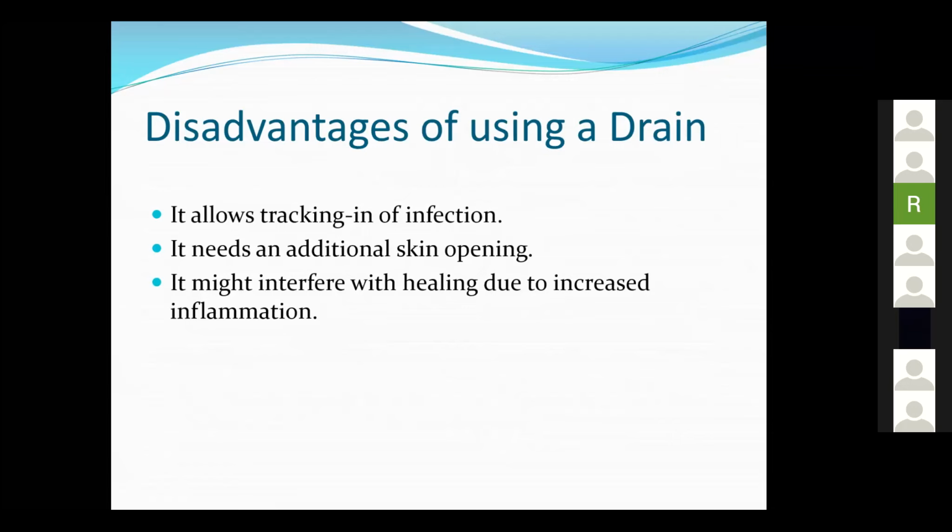I can give you an example: when we do a mastectomy, you want the skin flaps to be approximated. So we put the drains there, but obviously the seroma keeps coming out, so you have to empty the bottle. Whenever you are emptying the bottle, you are opening it to the atmosphere. You may be using sterile techniques or not, so you are exposing the wound to infection. And if you are forced to leave the drain there for a longer period of time, then there is a risk of the wounds getting infected.